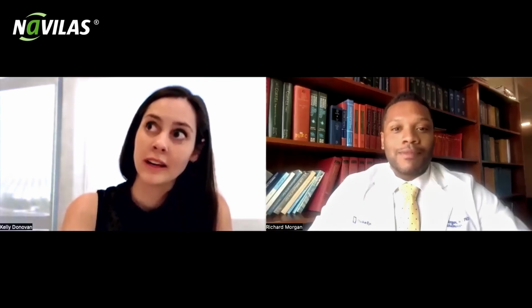Like I said before, I think it's really critical for everyone to know how to use indirect laser as well as direct laser. I don't think you can skip those over, but I think that the Navilas definitely has a lot of advantages that we sincerely appreciate. And at the bottom line, of everything is to optimize patient care, and we want to do the best thing for our patients and give them the best that we have to offer. And I think that Navilas has definitely added to our ability to do that for our patients.